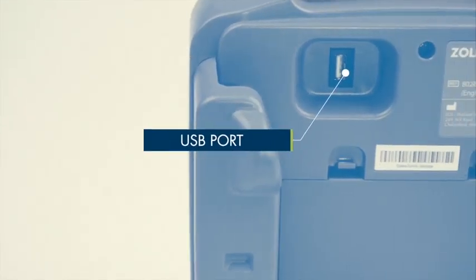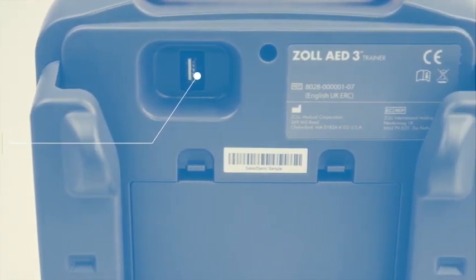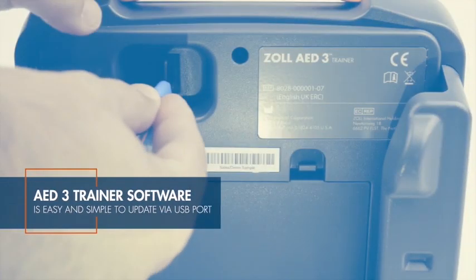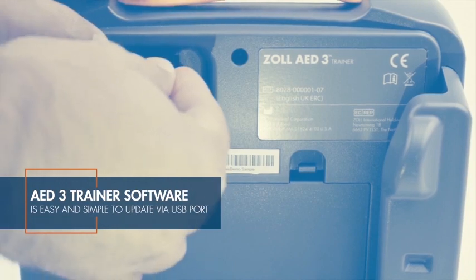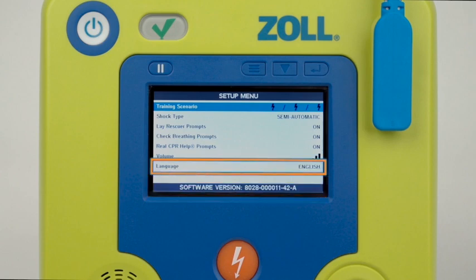The Zoll AED-3 trainer is easy to update with new software. If guidelines change, you can simply update the trainer's software with a USB stick with preloaded software. You can change the part number by updating the software, and you can also change the language package in the field.